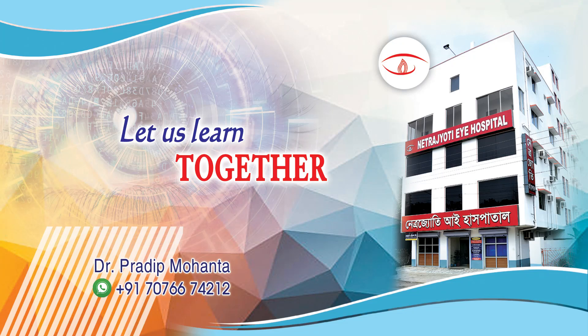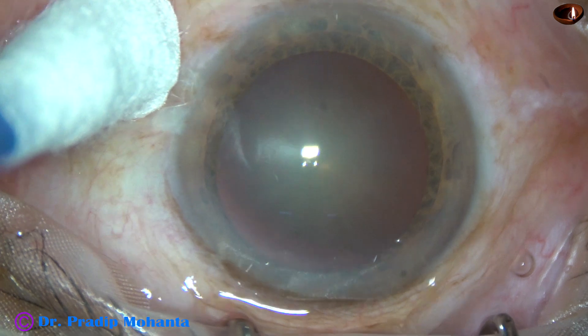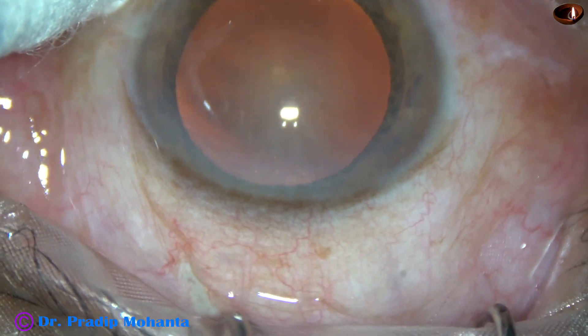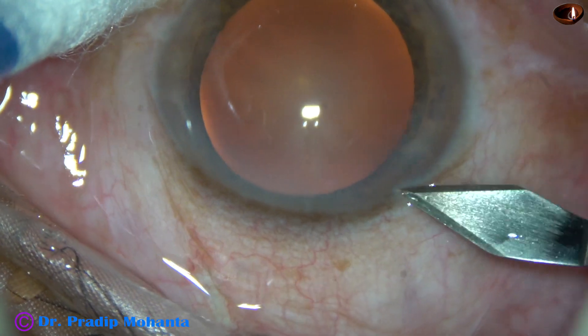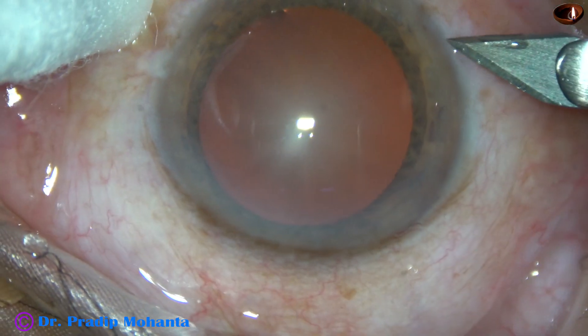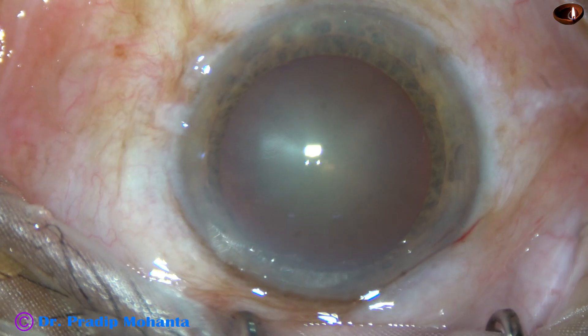Friends, welcome to my workplace at Ranaghat, West Bengal, India. This is a cataract with grade 2 nuclear sclerosis. It is believed by some colleagues that it takes a lot of time to manage such cases with this phaco machine using 3 vacuumations. This is a totally unedited real-time surgery. Let us see how much time it takes to manage this case.